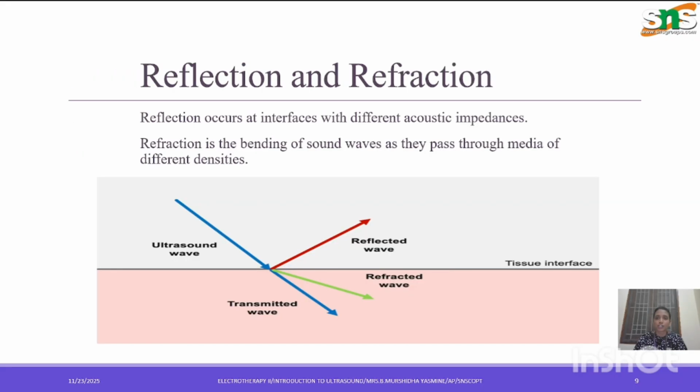Reflection and refraction are the major principles used in therapeutic ultrasound. Reflection occurs at an interface with a different acoustic impedance. Refraction is the bending of the sound waves as they pass through media of different density.